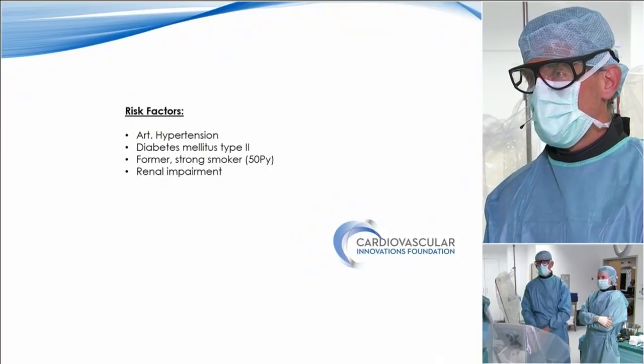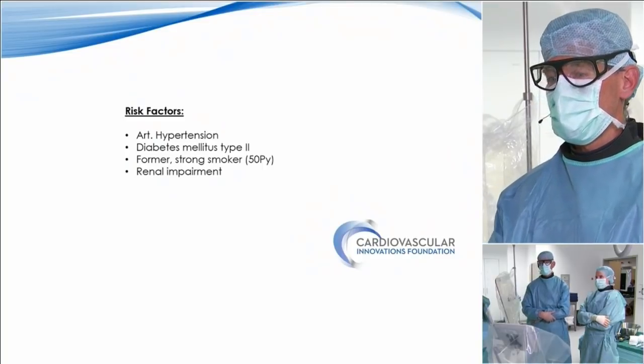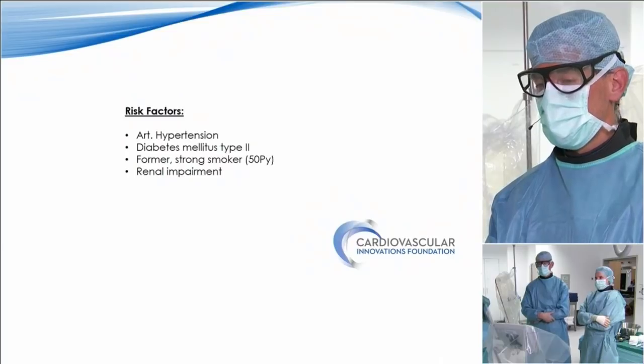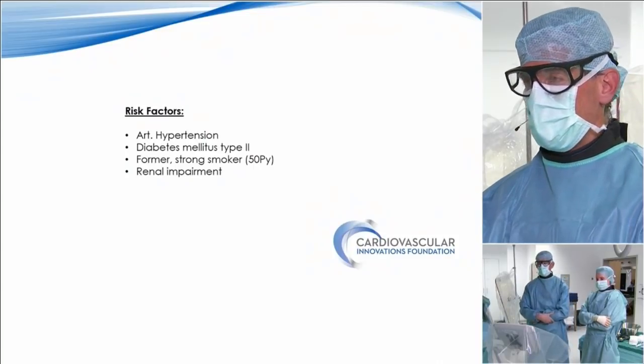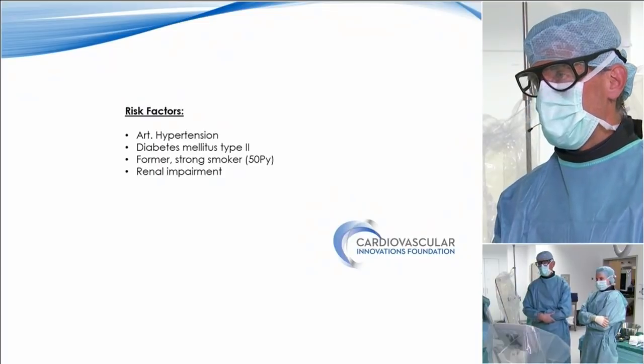Andrej, while you start working, I just can't hold myself from asking this question: after the SFA is transected so many years ago, does it recede away and you have no idea where it is currently? So any kind of imaging before this procedure would help you. You can continue with your work, but this is something worth considering, I think, for us. Yeah, I don't think so.